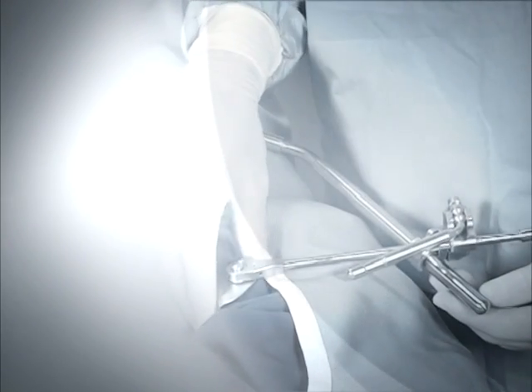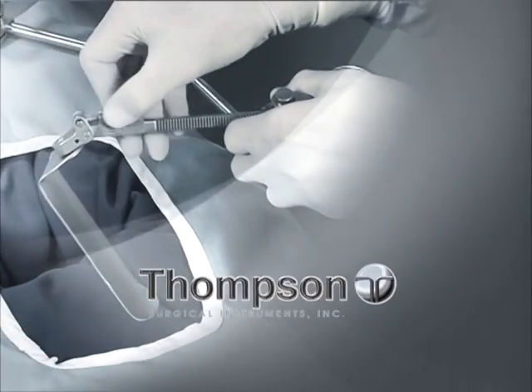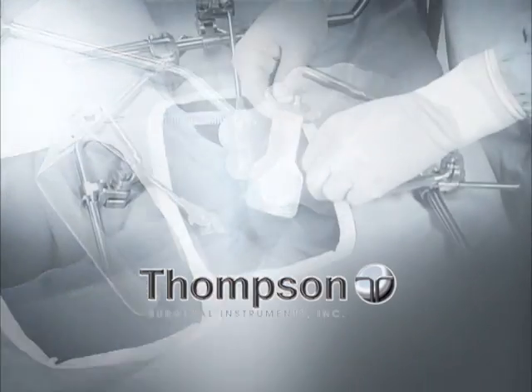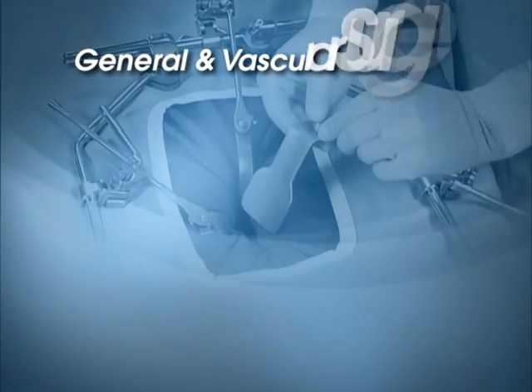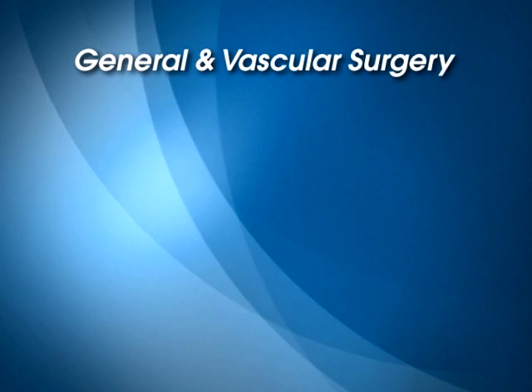The Thompson Retractor is the original table-mounted retractor that outperforms any other retractor system, including the human hand. In general and vascular surgery, the Thompson Retractor offers the following exclusive advantages.